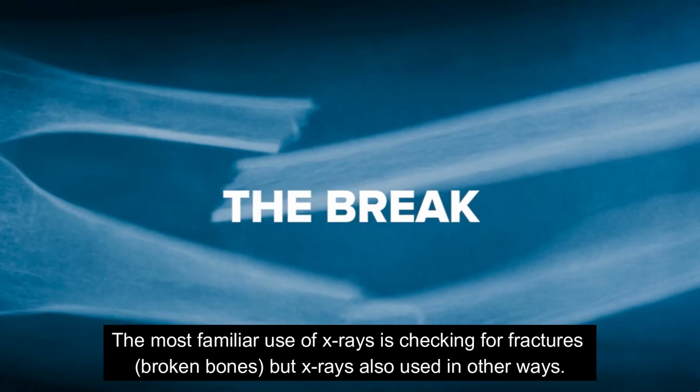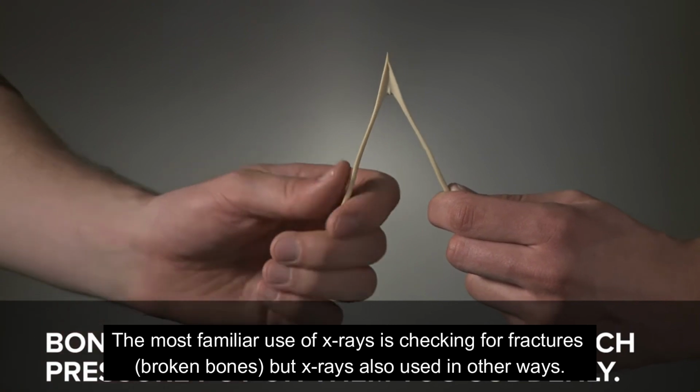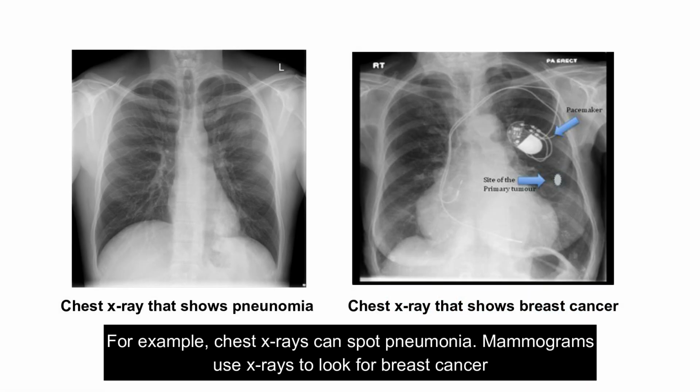The most familiar use of X-rays is checking for fractures, such as broken bones, but X-rays are also used in other ways. For example, chest X-rays can spot pneumonia. Mammograms use X-rays to look for breast cancer.